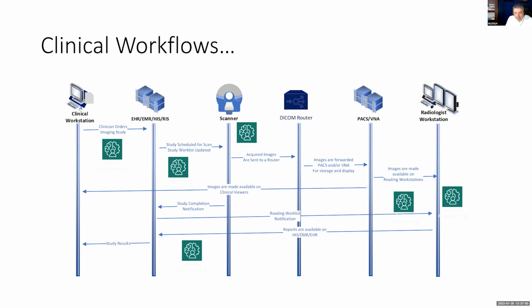AI goes in that space, like how to order the best exam, or there are other down the line algorithms such as what is the best slot to schedule a patient to on a given scanner or time zone. This is not what we're covering. We're more in the pixel space, or we're not covering what the report should look like. And there is natural language processing based AI or voice recognition software that handles that. We are not covering that space.